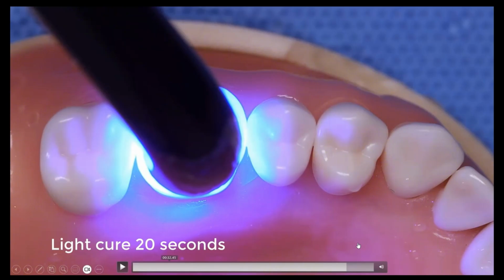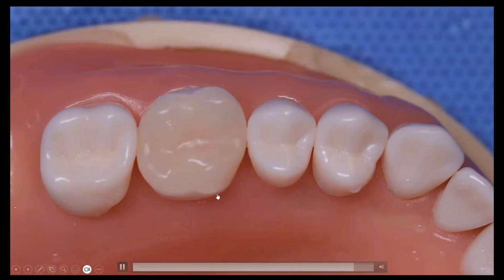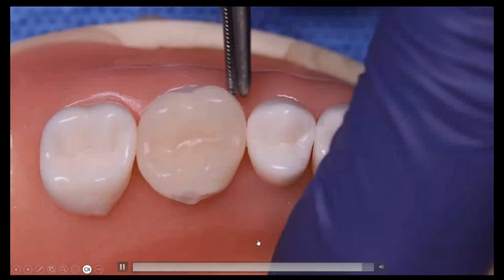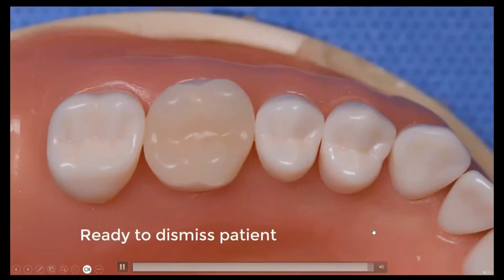Now, if this comes off, we have to tell the patient a couple of things. One is please drag the floss through. Don't pop it back up. You could also use Duralon instead of going through the spot bonding. Duralon works really well for holding this, as you know. And some people will use a product similar to like the old Fermit, but I don't like that. But if you do use that Fermit product, please pack Teflon, sterilized Teflon interproximally, so that it's not going to irritate the tissue. There's nothing worse than having the tissues irritated when you're trying to bond in your final restoration. So I hope that makes sense.